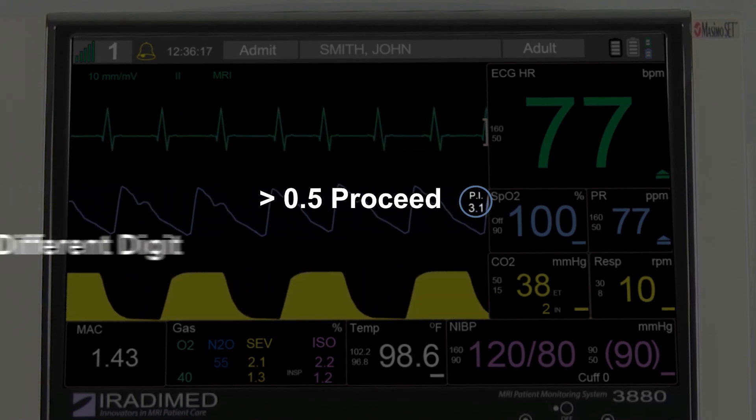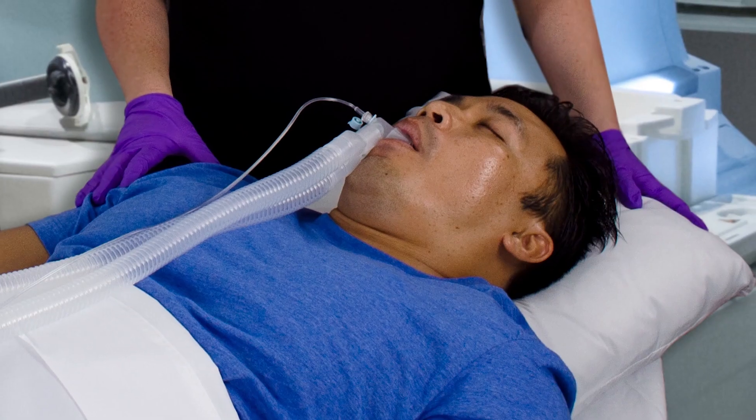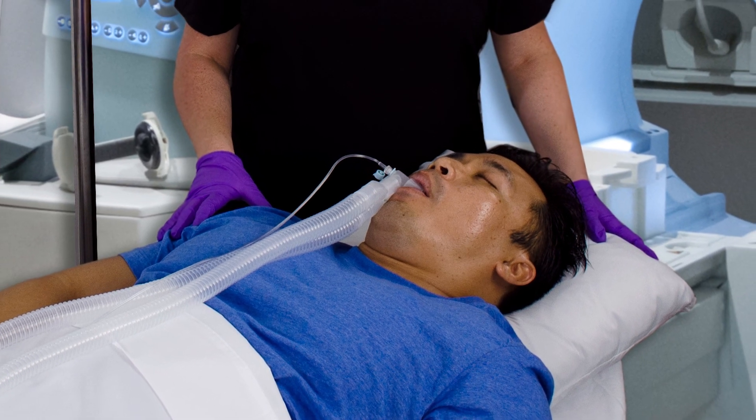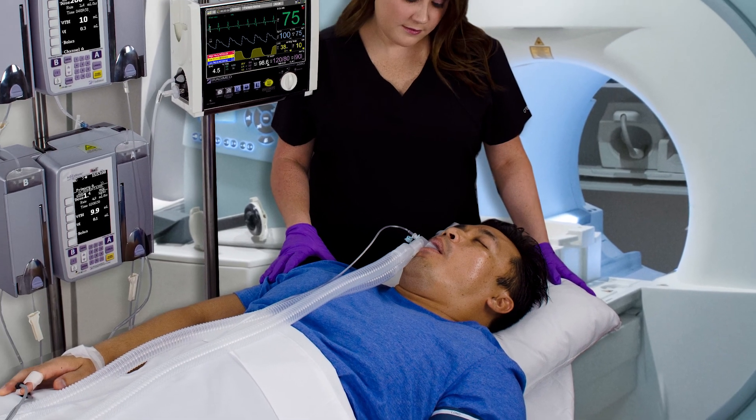If the perfusion indicator is less than 0.5, then select a different digit and proceed to step 2. Before entering the MRI room, also known as zone 4, be sure to place the L-Pod on a blanket or towel to minimize MR vibrations.